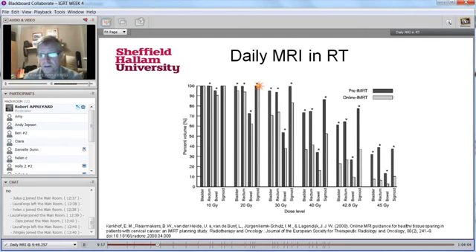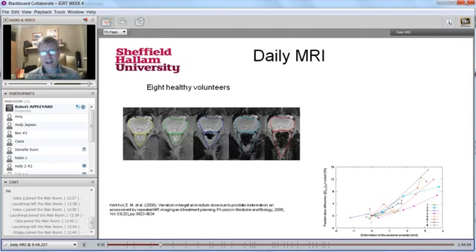But there are also some ones that are very big. So if we look at here, and then again here, and certainly as we get towards these higher dose levels, these are all very, very significant differences and show the value of using online MR guidance. And bearing in mind this is for a particular category of patients. These are all cervix patients. So this sort of established how valuable this MR guidance could be.